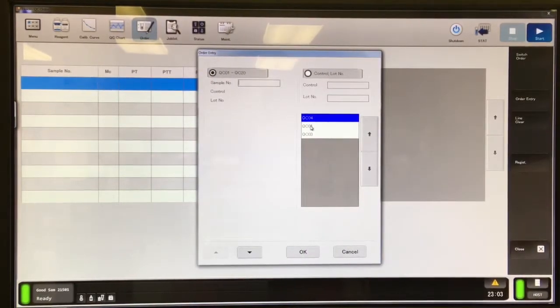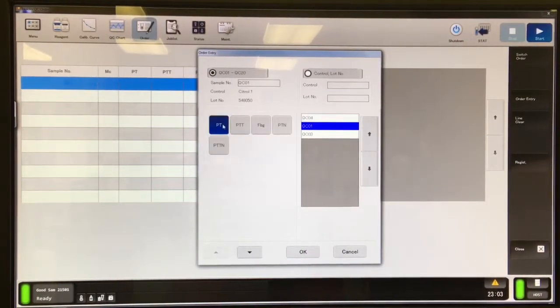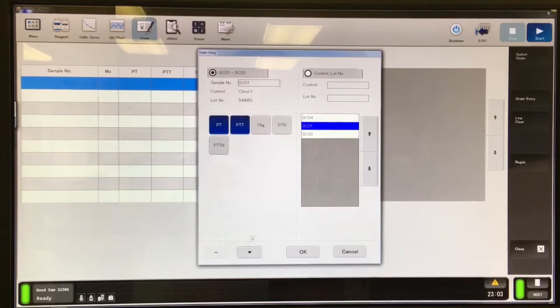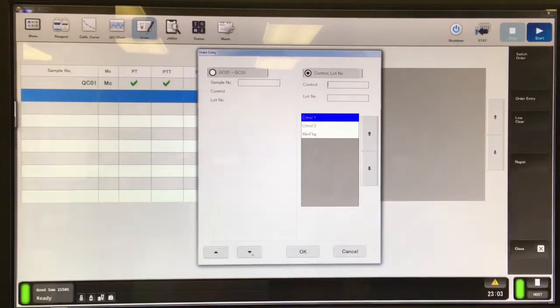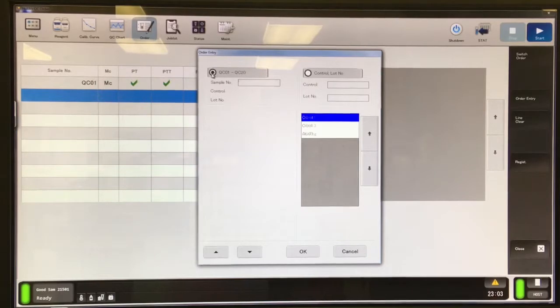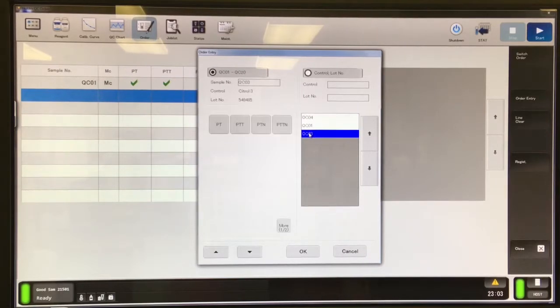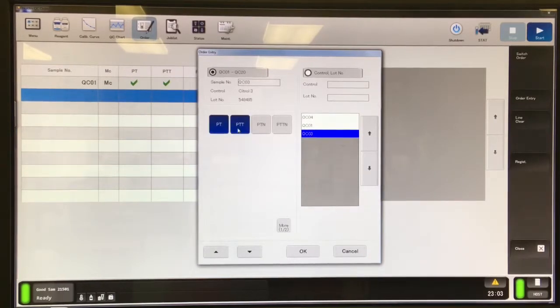I'm using the QC on the left here, and I'm going to select my PT and PTT for QC level 1, which is my normal, and then I'll order the same thing for my QC level 3.